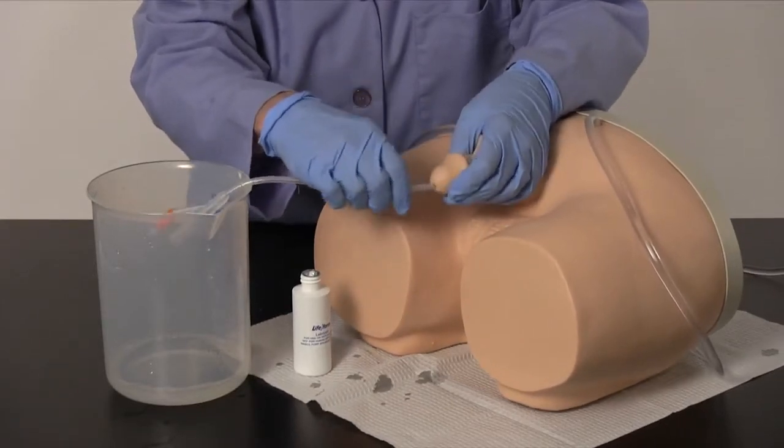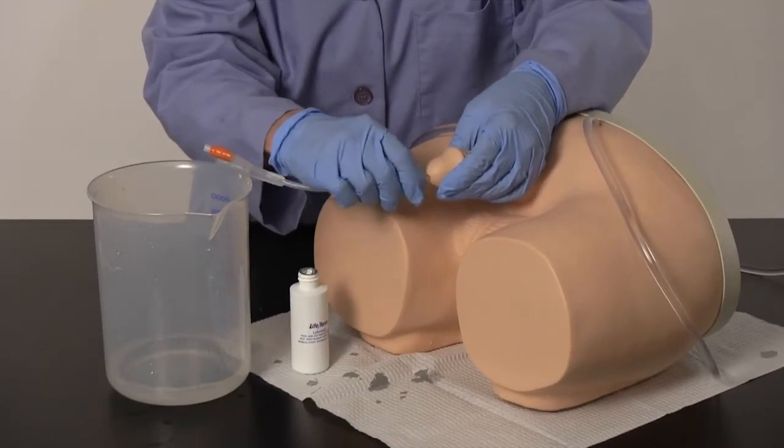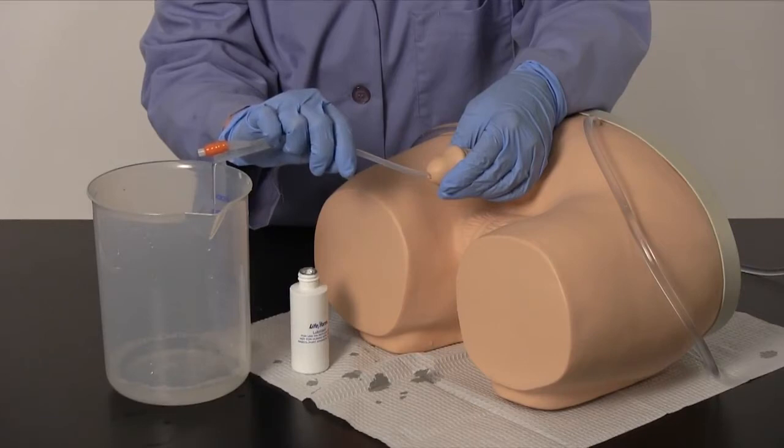The final restriction is the simulated sphincter when entering the bladder. Lower the penis and continue inserting. You will feel a slight pop as the catheter enters the bladder. Continue inserting until water flows from the catheter.